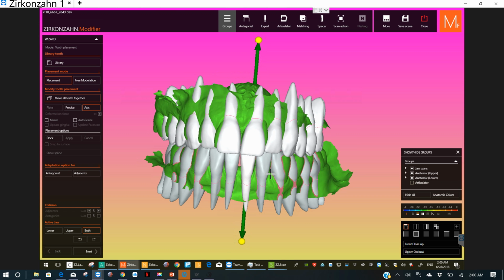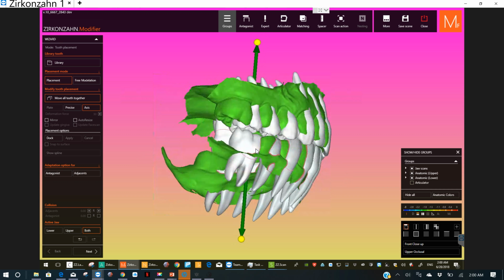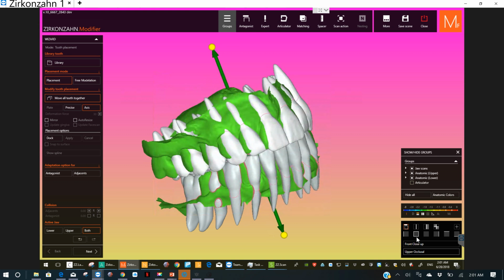Okay. And this is so cool because it'll bring in, like, we needed a tooth right there, so this is going to give us an extra tooth so she can start getting used to it before the surgery. And if she hates it, she can let us know. All right.